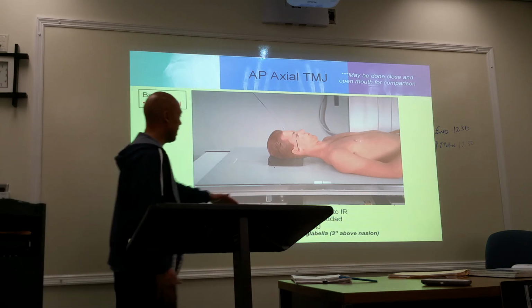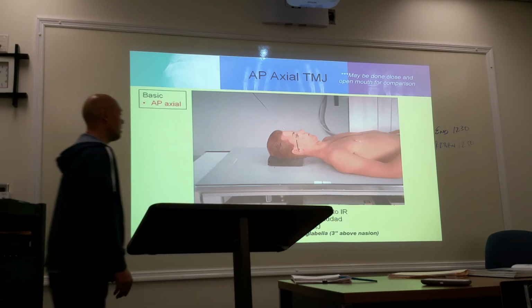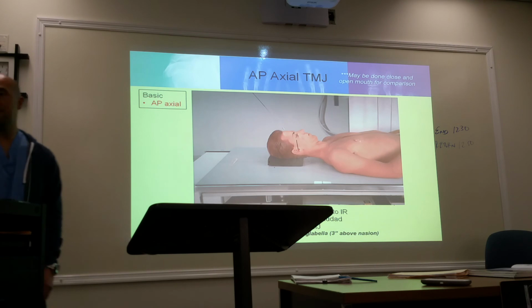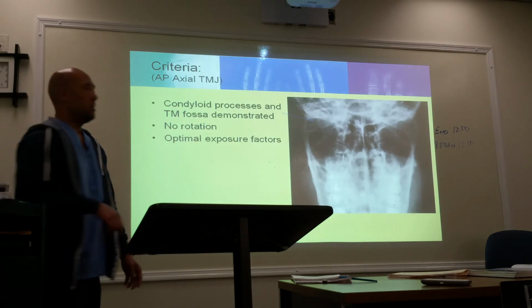So here we go again. OML perpendicular to the image receptor. Your angle is going to be 35 degrees. Center is going to be 2 inches above the glabella. Okay, 2 inches above the glabella, to exit the TMJs.